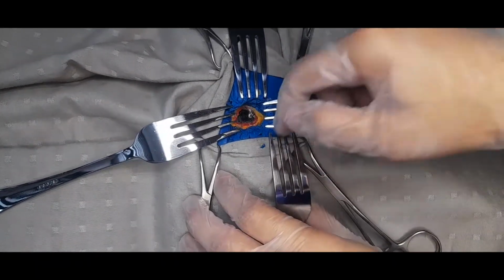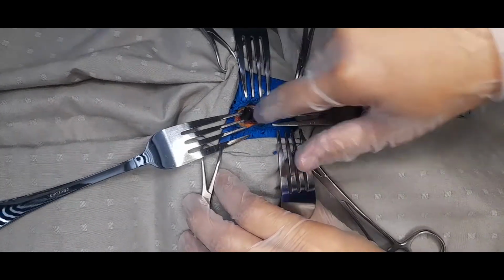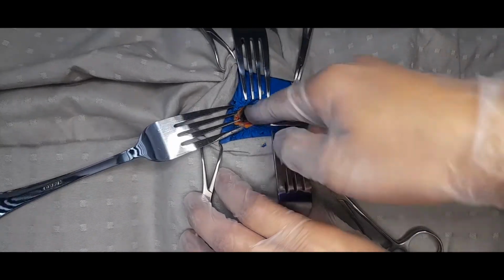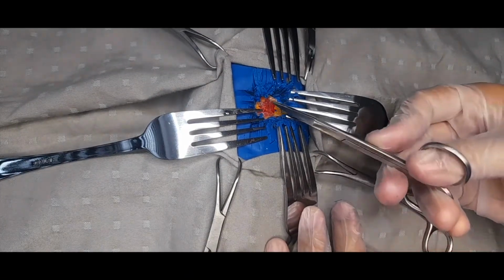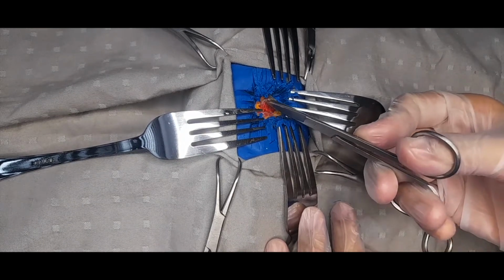Intermittently palpating the airway at this point is important as it is easier to stray from the midline. Once the fascia has been cleared, identify the strap muscles and retract them laterally. Then expose the trachea by carefully parting the overlying soft tissue with a pair of scissors.